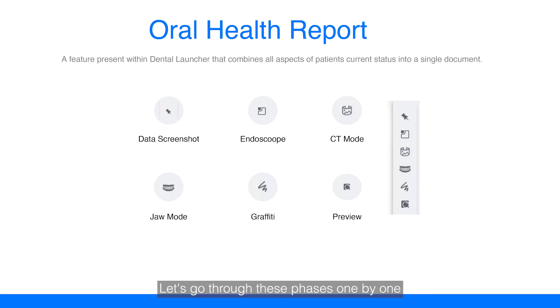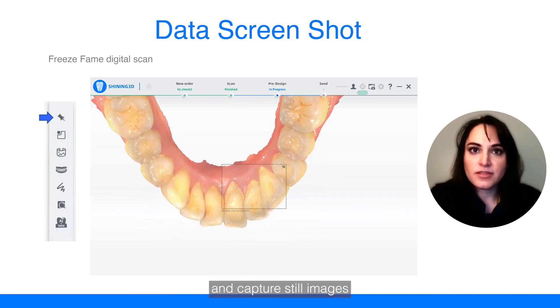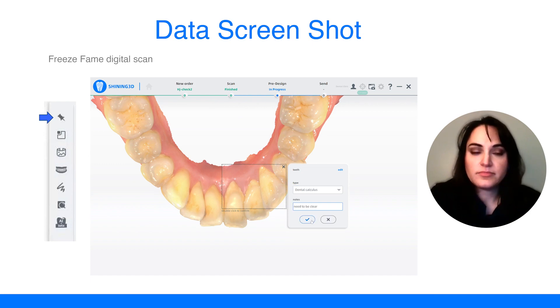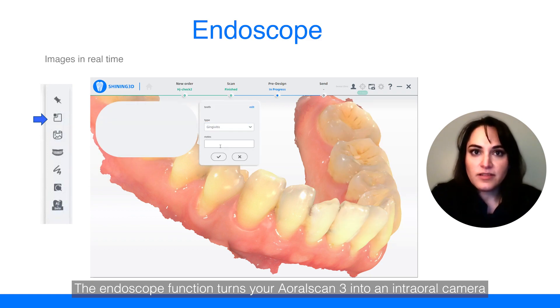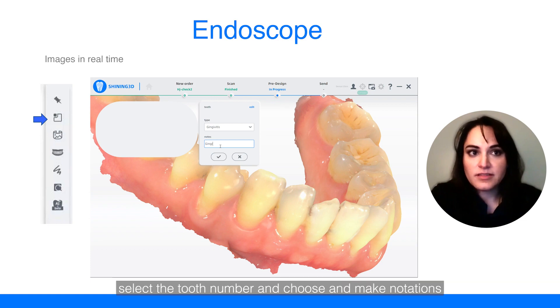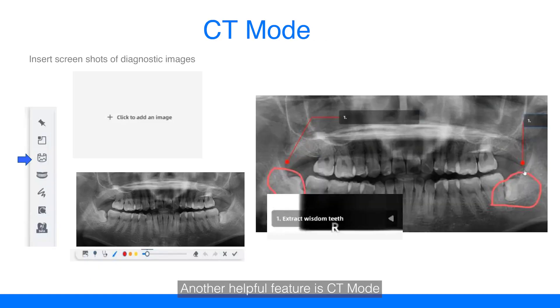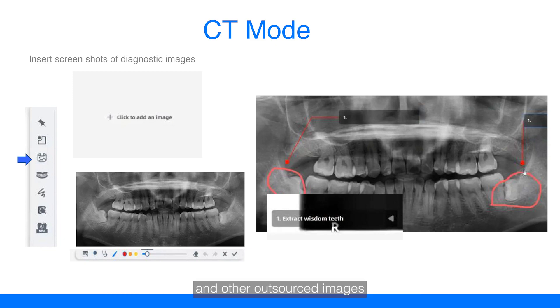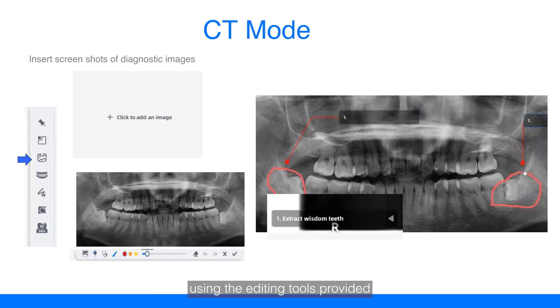Let's go through these phases one by one. Data screenshot allows the user to rotate the scan and capture still images, note the tooth number, and note the pathology or lack of pathology present. The endoscope function turns your AeroScan3 into an intraoral camera that allows for real-time still image capture. Select the tooth number and make notations based on the information. Another helpful feature is CT mode. This allows the merging of radiographs, periodontal charting, and other outsourced images by inserting them into the oral health report. Make annotations and draw on the inserted documents using the editing tools provided.